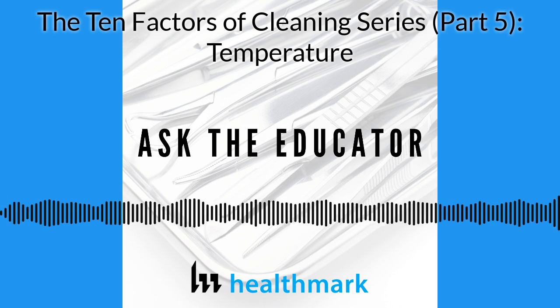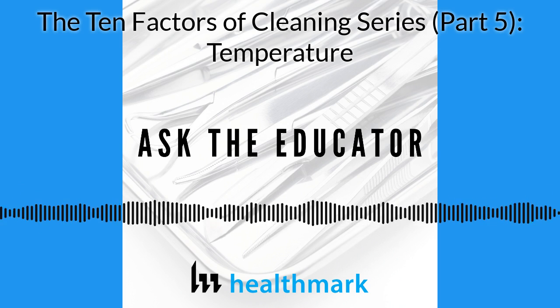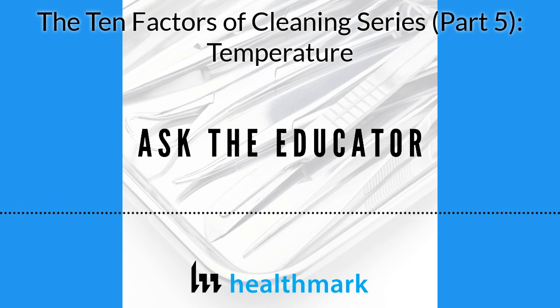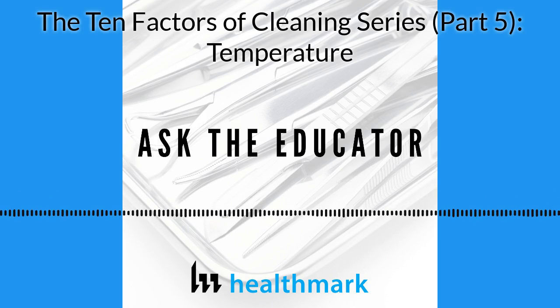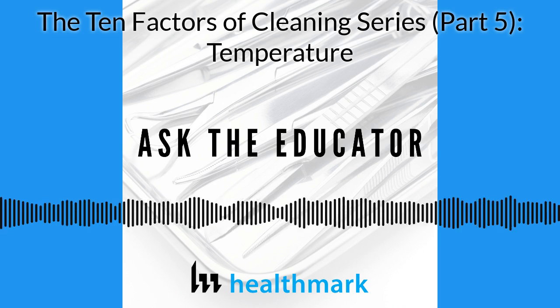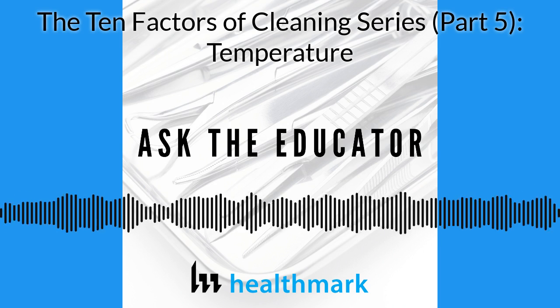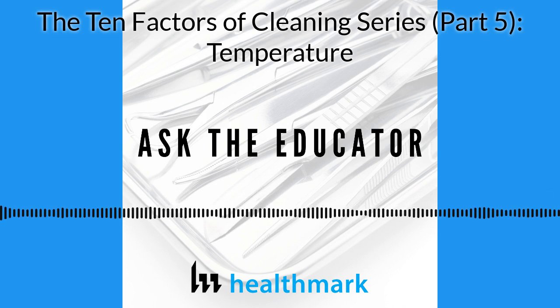So you have the rinse in the beginning that's colder, and then you might heat up for the enzymatic, and then you might see even a higher level of heated water in order to accomplish thermal disinfection. This is the part that we all need to be aware of, that is kind of a nice component to the automated washer or an automated cart washer, is that it provides that low-level thermal disinfection, which helps render those devices safe to handle on the other clean side, and something that we have to try and account for, I believe, with the hand wash items.